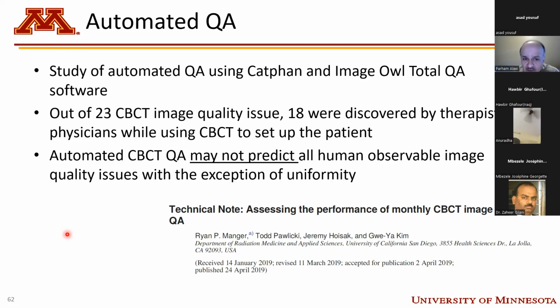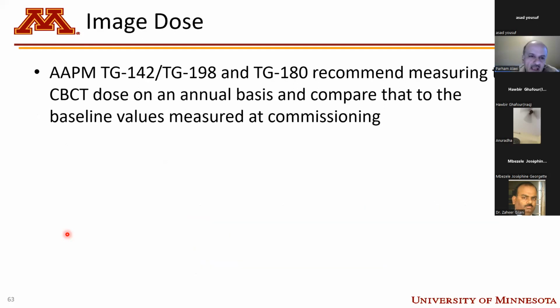So automated QA may be usable. I mean, it is probably a good idea, but it may not catch everything. So I think we still have, for the foreseeable future, to use some manual intervention doing QA on this.